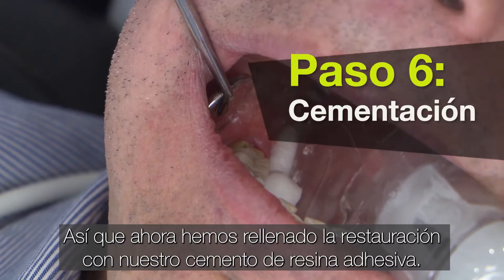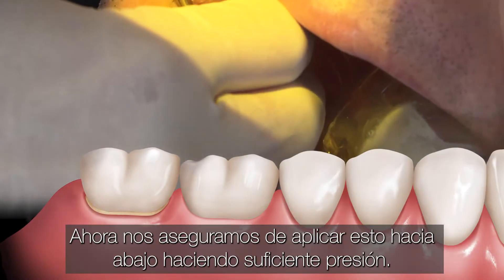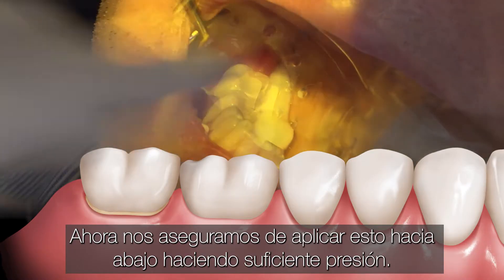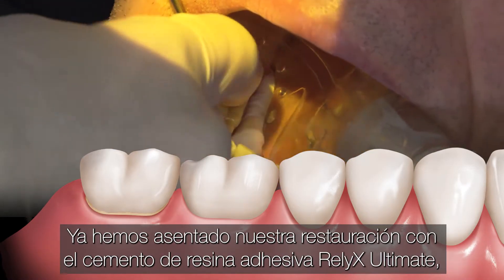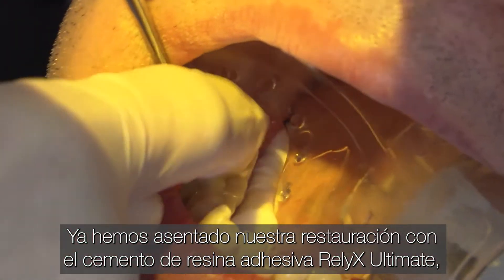We've now filled the restoration with our adhesive resin cement. Now we make sure we apply that down with good pressure. We've now seated our restoration in with the Relyx Ultimate Adhesive Resin Cement.